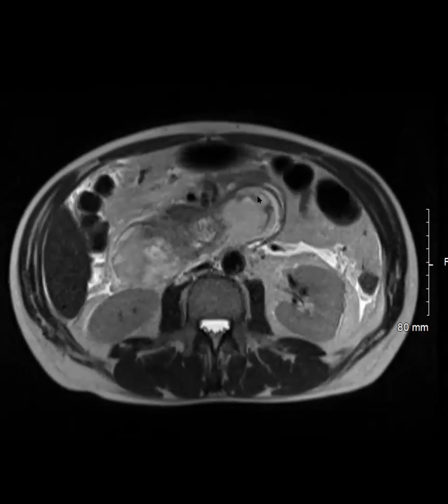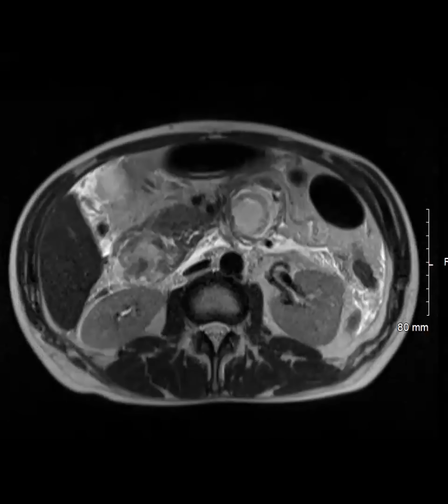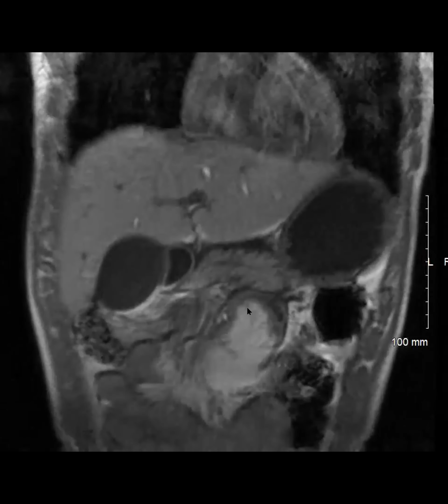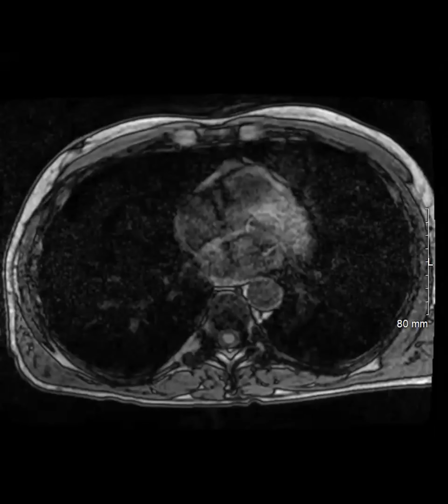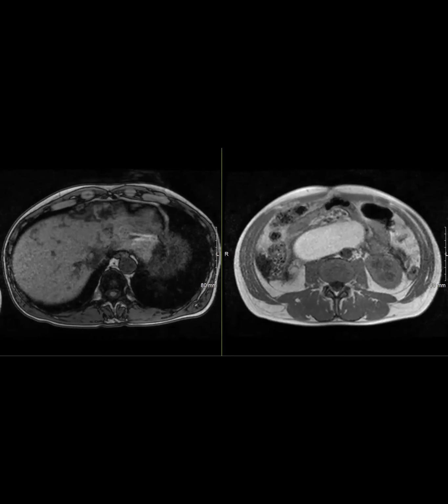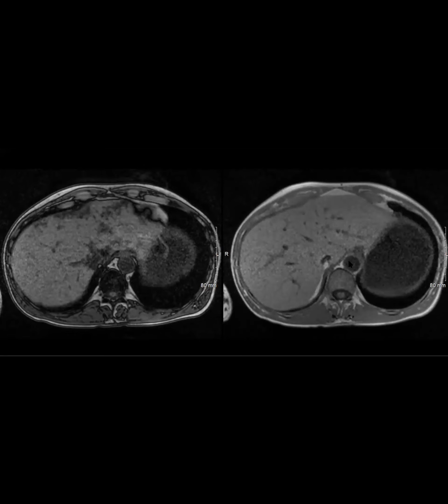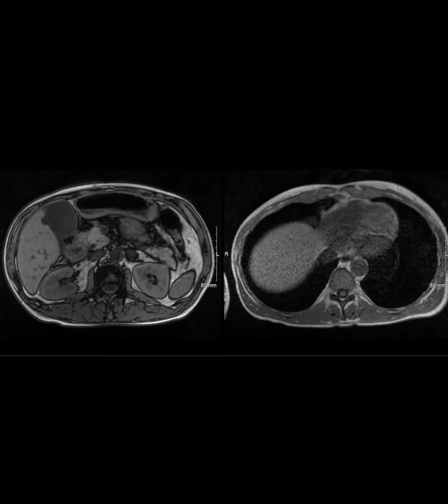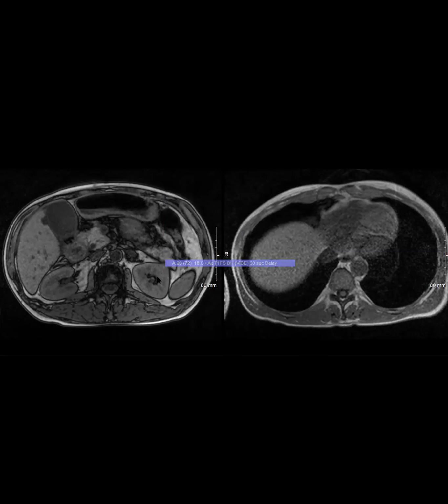And now we see this big hemorrhagic appearing collection. And here it is on coronal. You can see that it follows the curve of the duodenum right here. Let's see, this is in and out. So it's some sort of hemorrhagic collection. You can see it's bright on T1, doesn't have any fat drop. You can see that the patient's liver does drop here. So he has fatty liver, he has pancreatitis, so he probably has alcohol use disorder.